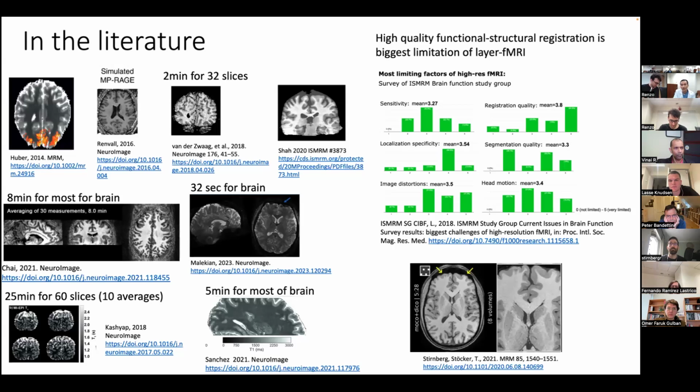Presumably, this is due to the fact that EPI is noisier, requiring extremely long acquisition times with whole brain coverage and averages. But EPI also has an issue of another dimension, which is EPI phase artifacts. The goal of this abstract is to take this 3D EPI approach to mitigate both issues. Namely, we want a fast, distortion-matched, whole brain structural reference scan without EPI artifacts.